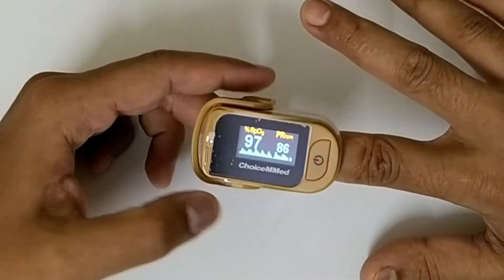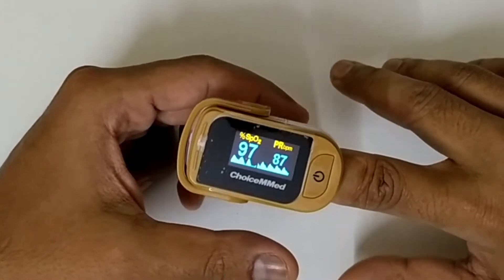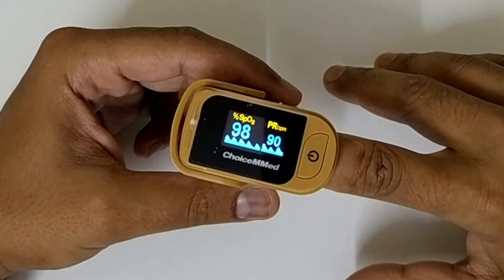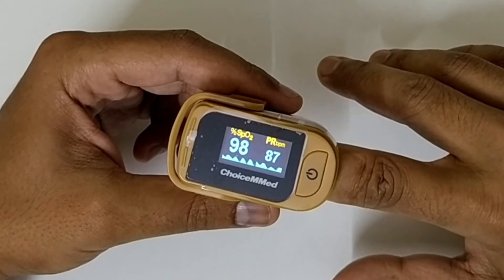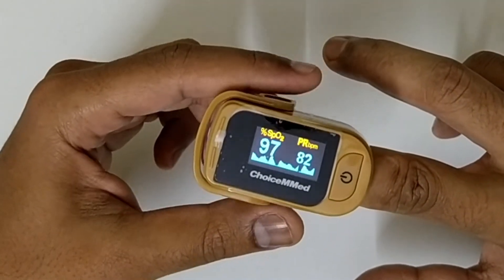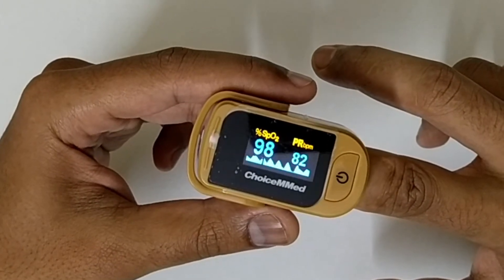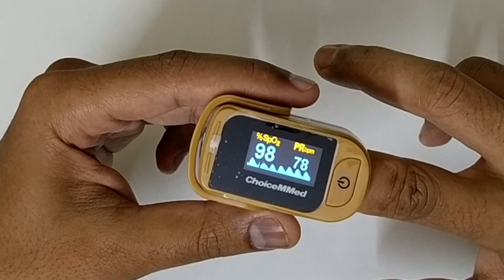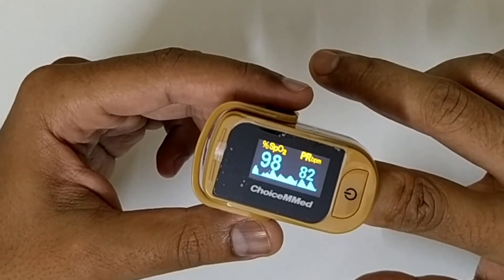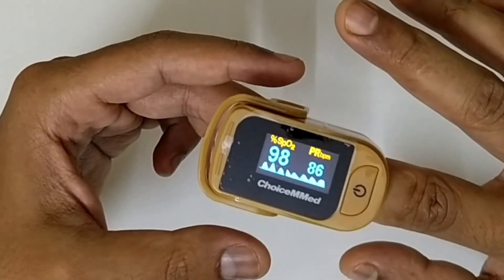The oxygen saturation in the blood is reading 97%, and the pulse rate is 81–82 beats per minute — a normal reading. Right now with the COVID situation, this is a very essential device to have at home, especially if you have older parents or older generation staying with you. When the saturation drops below 90%, you should consult your doctor, though it depends on your body structure, weight, height, and existing conditions like diabetes or blood pressure. Consult your doctor before acting on the readings, as concerns are on a case-to-case basis.